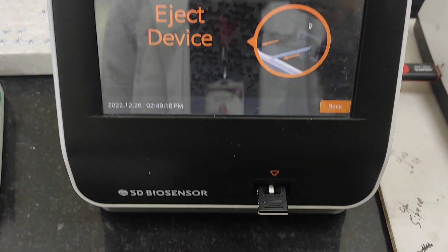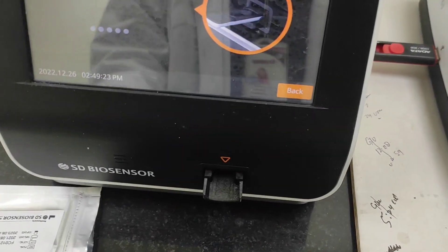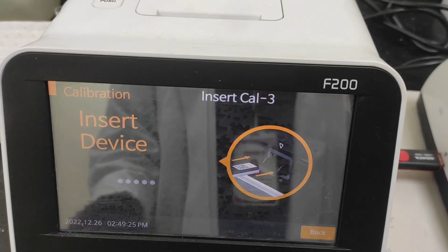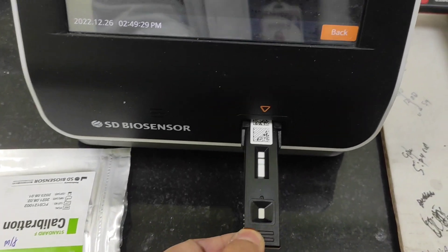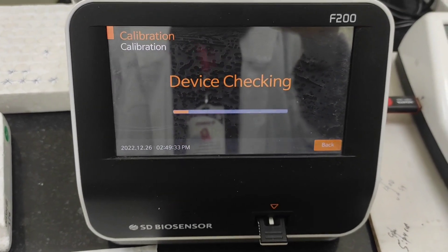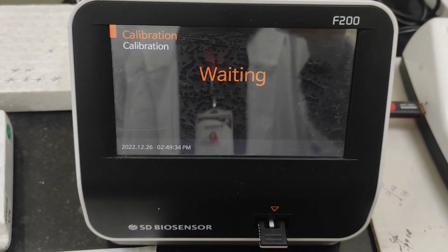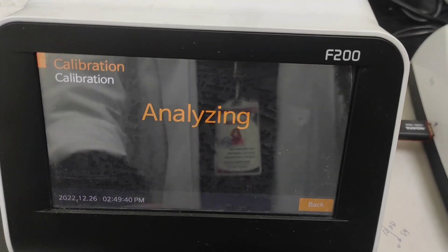Calibrating the machine is so important. Whenever the calibration date is due, the machine automatically asks for the calibrator — it prompts you to calibrate the device. I have now inserted the third calibrator here and it is analyzing, as you can see.